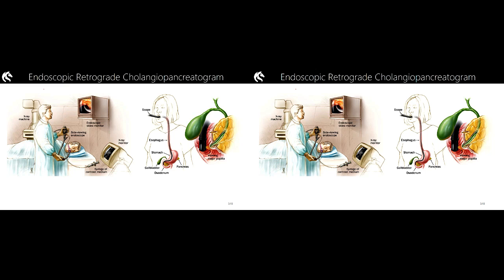The second, more practical reason, is the fact that this patient is going to be prone, and we need to find a way to get access to the patient's mouth to put the endoscope in. So a slight degree of obliquity is useful in this. So we oblique the patient to get scope access and also to project the hepatobiliary contents off the spine.